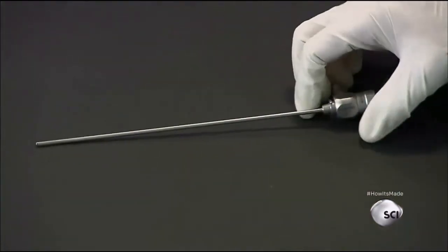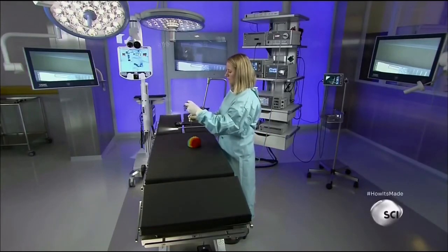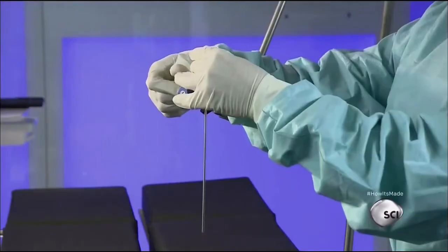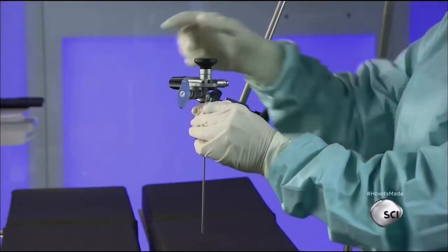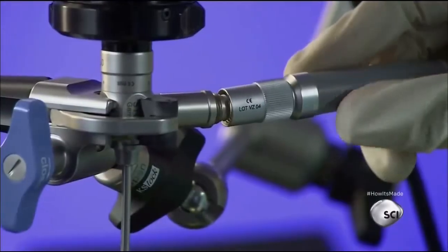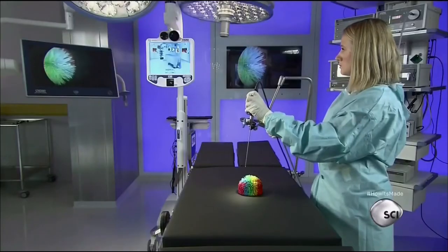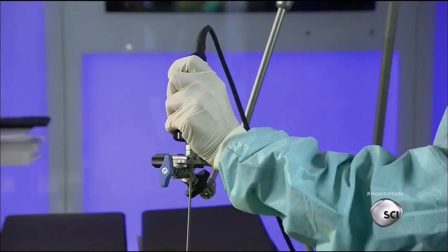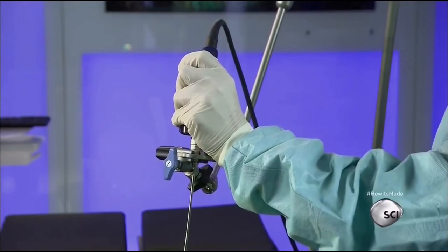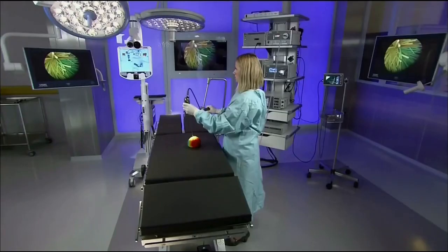This demonstration shows how it all comes together in the operating room. After securing the endoscope in a holding fixture, the surgeon attaches the light cable coming from the nearby light source. The light travels down and out the endoscope, illuminating the area the surgeon's working on. The lenses reflect the image to the top of the endoscope, where a camera transmits it to a video monitor that's mounted in front of the surgeon.